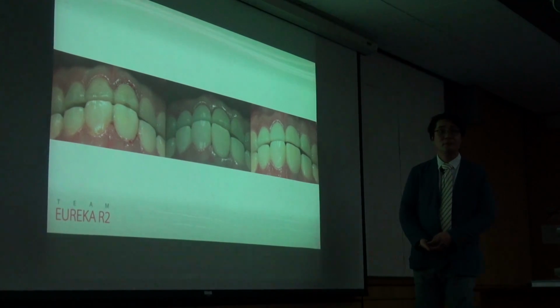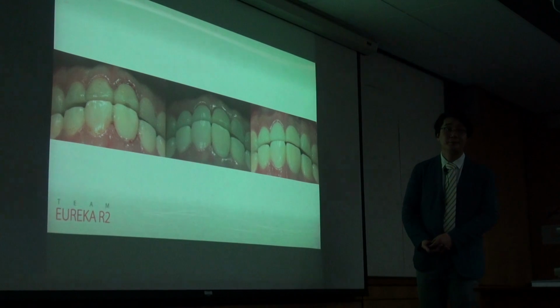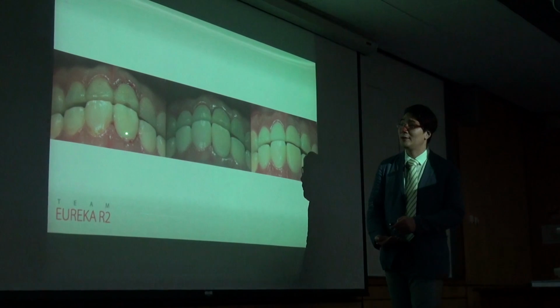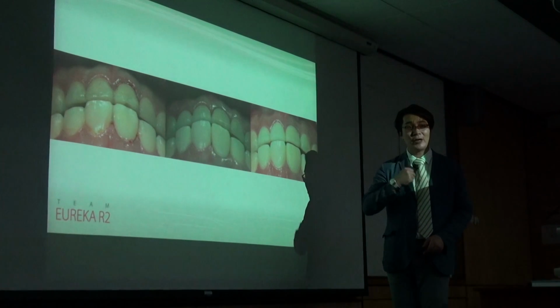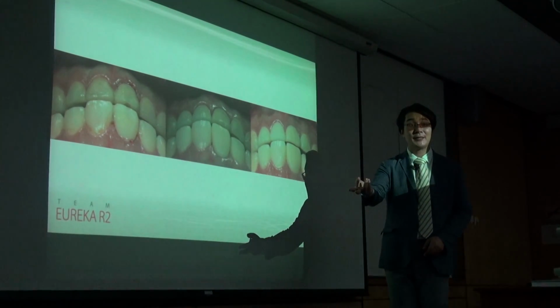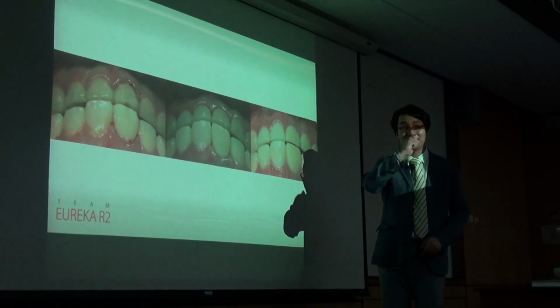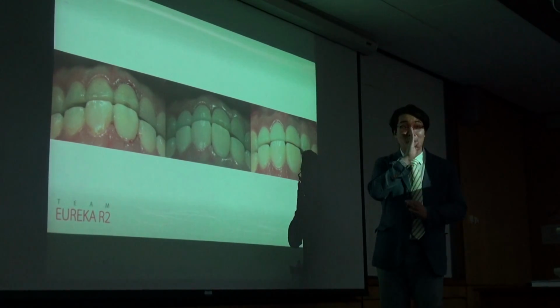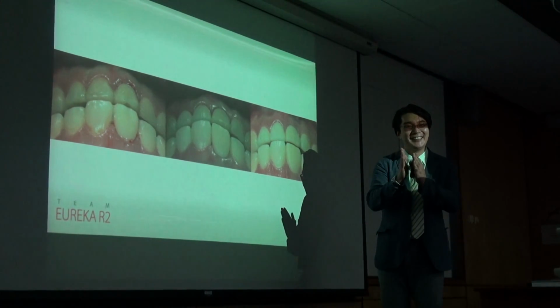Is that the slide on the right side that has the implant with the temporary crown? Do you normally tend to bond it to the adjacent teeth with composite? No. Is there bonding somewhere? Yeah, at this moment, this is the extract and place, the immediate placement case. So when you see the video, I cut up the proximal point. At the time, I cut a little bit larger.